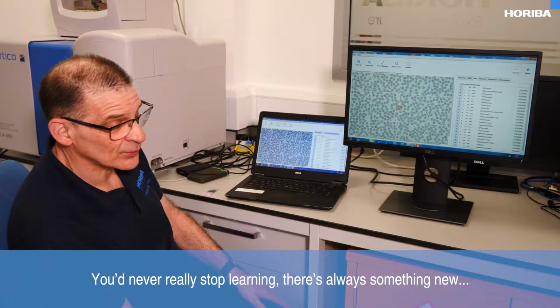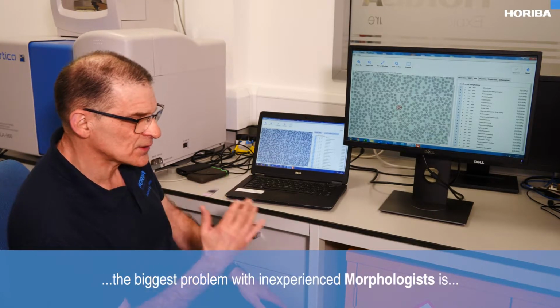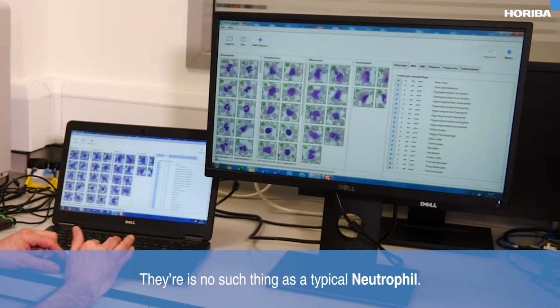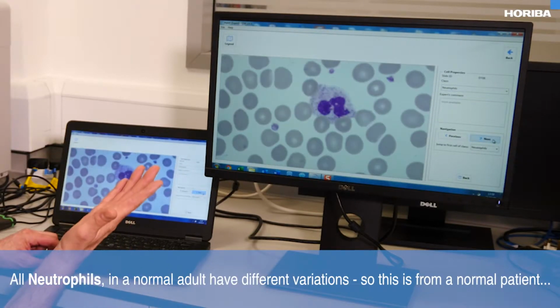You never really stop learning. There's always something new. The biggest problem with inexperienced morphologists is they need to know what the difference is normal is. There's no such thing as a typical neutrophil. All neutrophils in a normal adult have different variations. So this is from a normal patient.